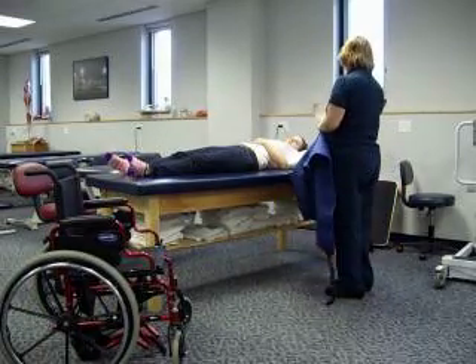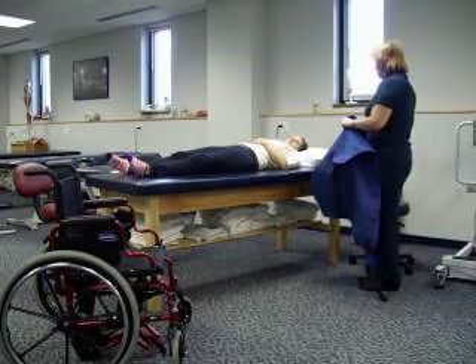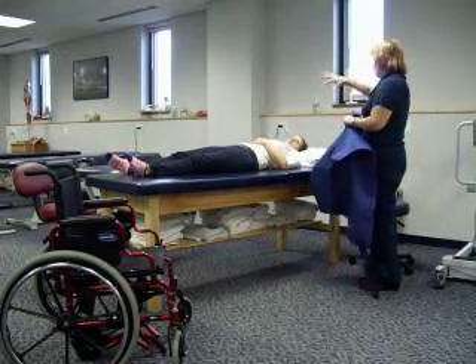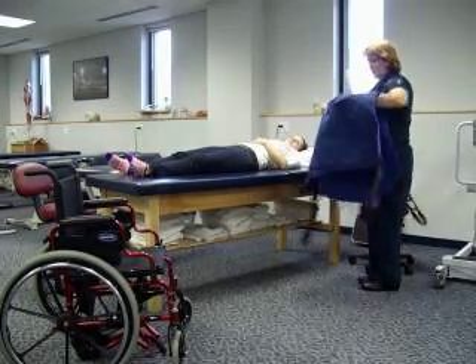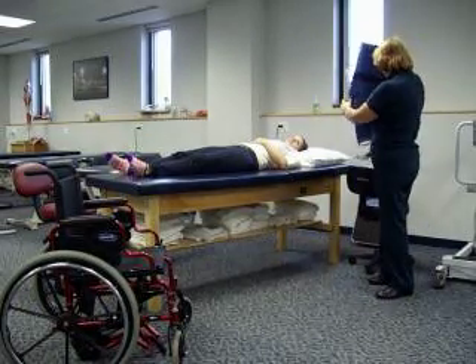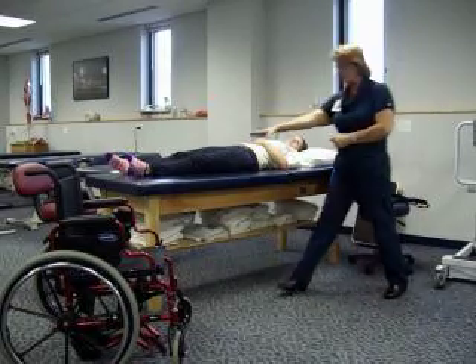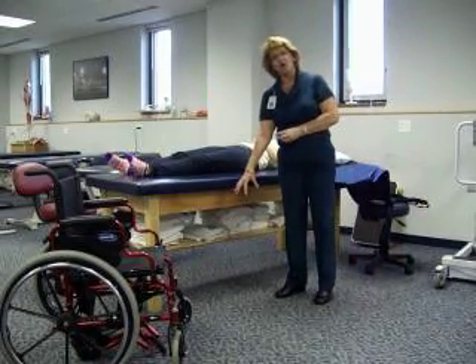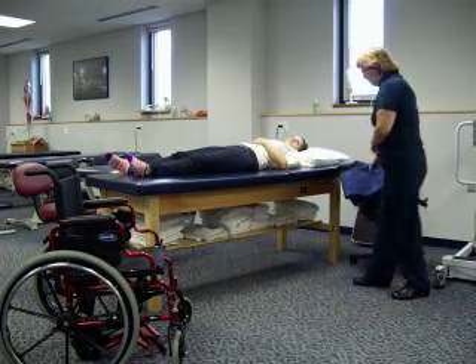I'm going to roll you up onto your side, place this underneath you, and then lay you back down. Then I'll walk around and pull it up from the other side to even it up. It's easiest if you put a chair next to you to hold the sling — you don't want to put it on the floor, and if you put it on the table it's easy for it to fall off in the middle of your maneuver.